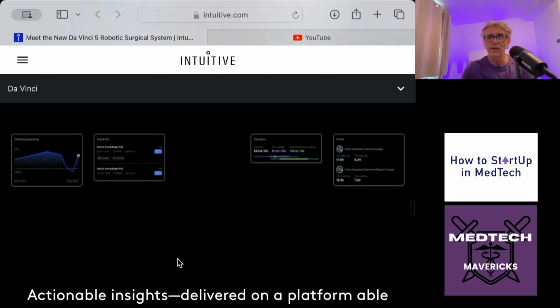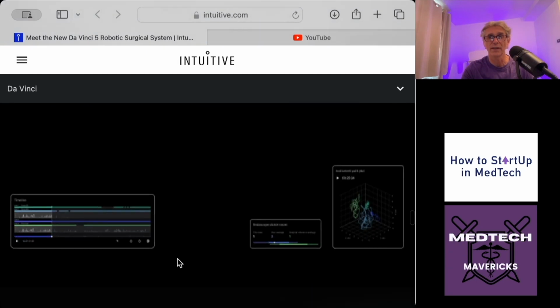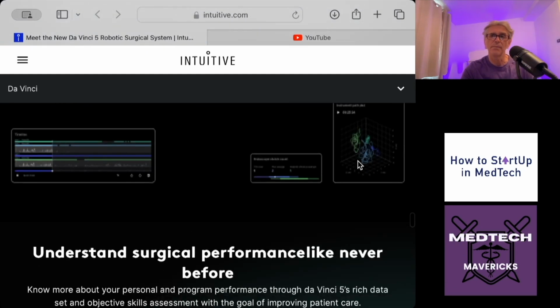And the data coming off these things now is very, very powerful, including things like full hand movement kinematics, which is going to go in there as well. What this is going to do, no one's really 100% sure yet, but you might be able to see novices versus experts by the way that they move their hands. A little bit of controversy over that. But you'll be able to link it throughout the whole performance of a procedure.